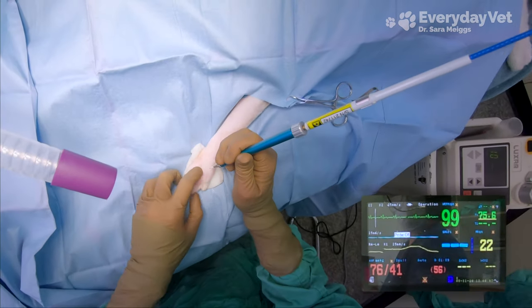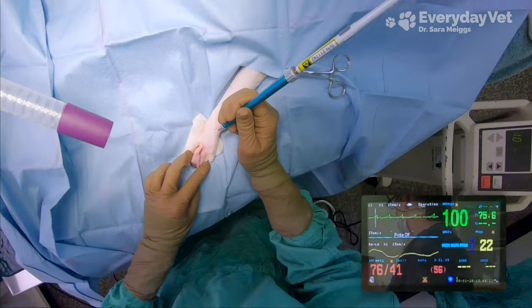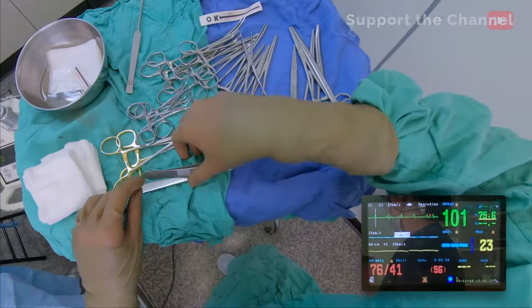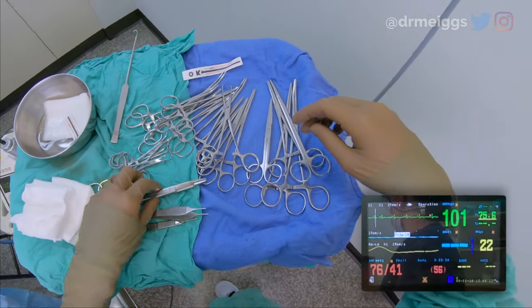This patient has a blood pressure cuff on his back leg, and that's hooked up to the Cardell so that new readings can be taken during the surgery. When that mean number turns white, it means that the Cardell is taking a new reading. In an anesthetized cat, we want the blood pressure to stay above 80 over 40 with the mean above 60.